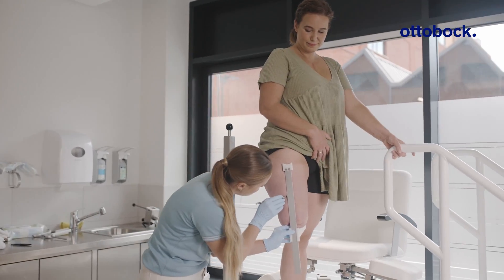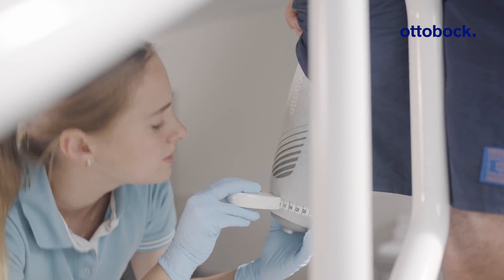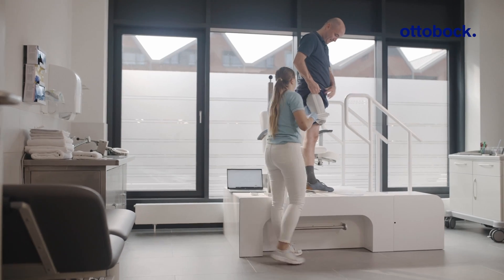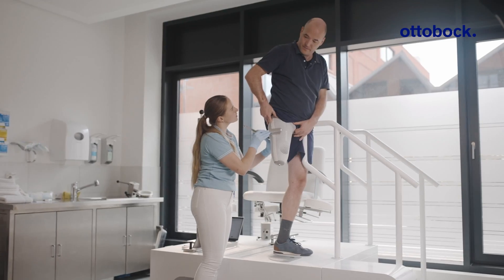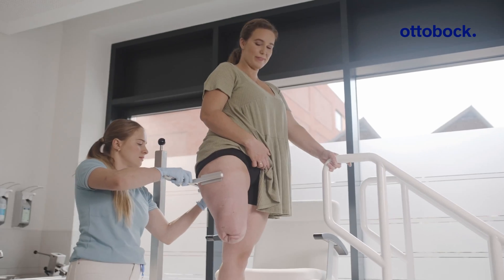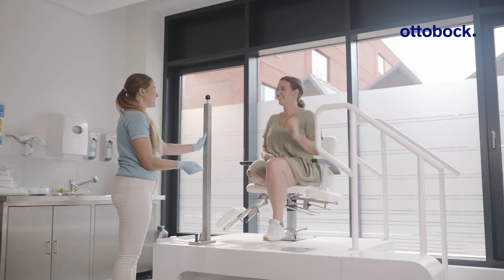MyFitTF gives us the ability to create a digital socket. For this we need four measurements: one length measurement and three circumference measurements, which we simply enter into the software model and modify our model as we like. Then we send it off and the next day we have our socket, which we can try on with the user.